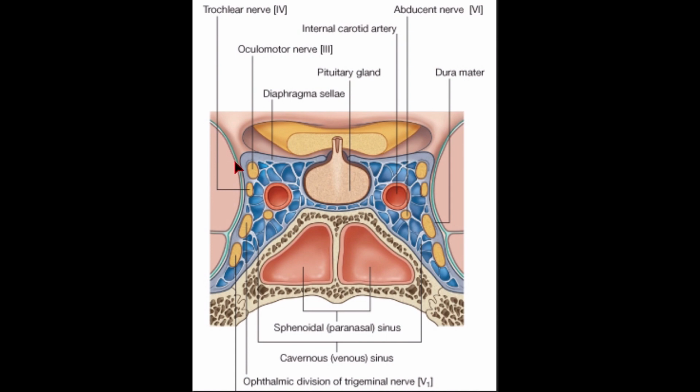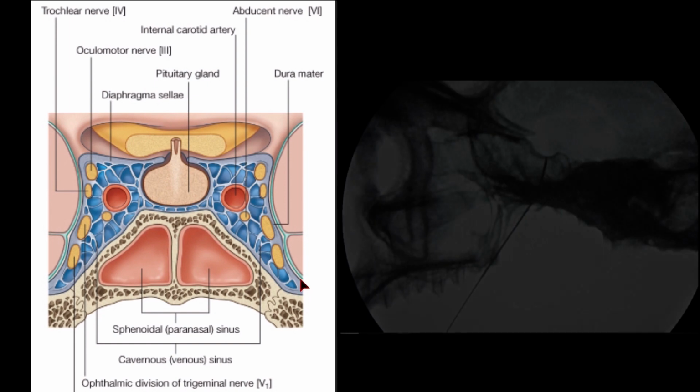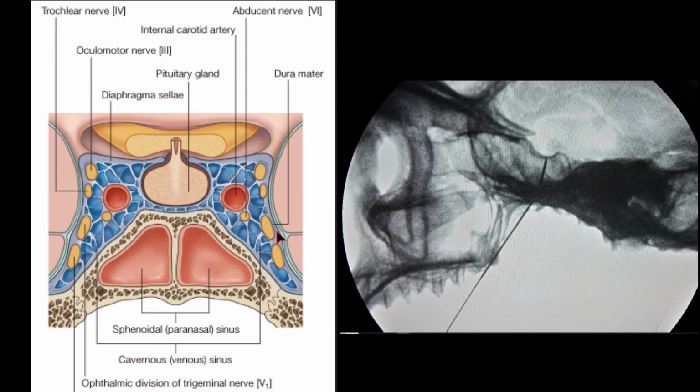So here, lateral part of the cavernous sinus, we can see the temporal lobe, both sides. So when you are putting the needle for V2, V3, we are keeping the needle in this area. So you have to be very, very cautious. You will puncture the dura, you may puncture the sinus. So your needle should not go too much inside. You can puncture the internal carotid.